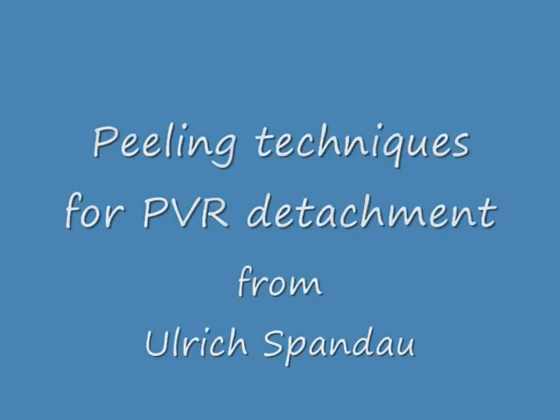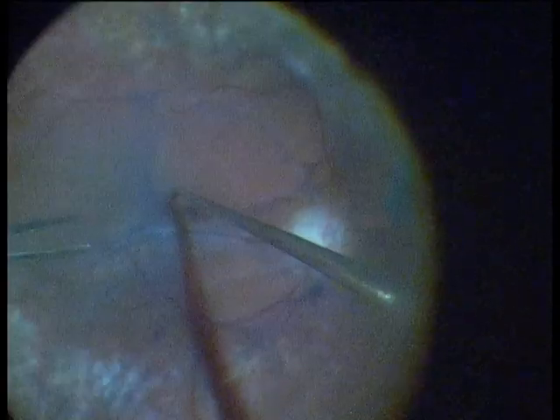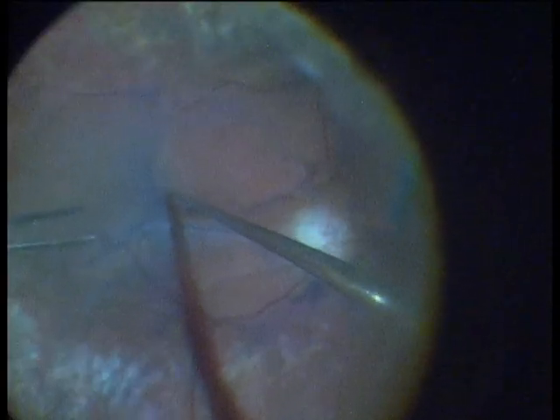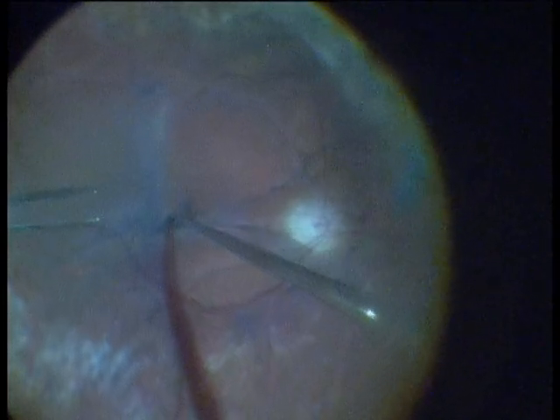Before starting a peeling, I recommend the visualization of the membranes with TriPen Blue. Here you see the picture before the visualization. After a fluid-air exchange and dropping of the TriPen Blue on the membranes, here is the picture after. It is much easier to remove the membranes after dyeing of the membranes.